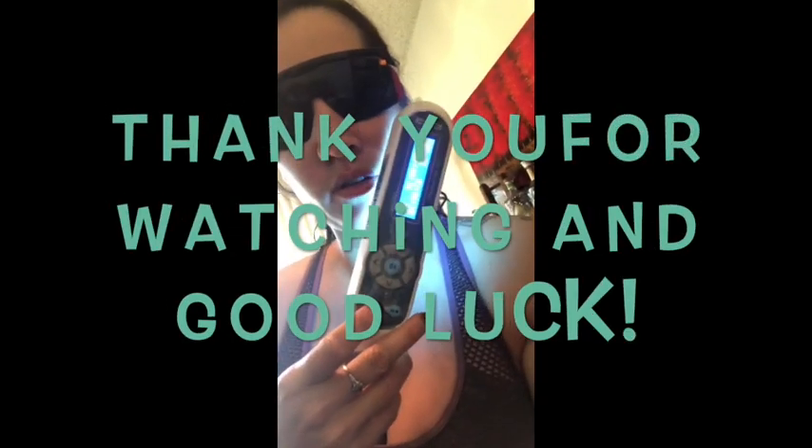To use this on your face, I highly recommend that you use the glasses. They are not super stylish but nobody's going to see you anyway. Set your time for the amount of time you want, turn on your laser, and just do the area you want to treat.